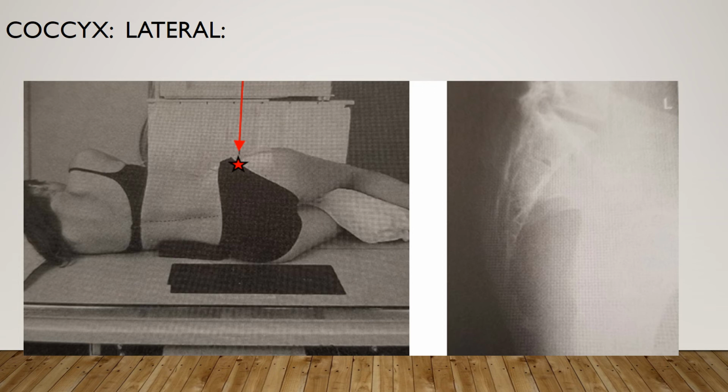In the image evaluation, you're going to have a lateral view of the sacrum, but more importantly the coccyx, a lateral view of L5-S1. No rotation is going to be evident by the greater sciatic notches, and the femoral heads are going to be superimposed. The entire sacrum and coccyx is going to be included. You're going to have optimal density and contrast with no motion, and trabecular markings are going to be clearly demonstrated.